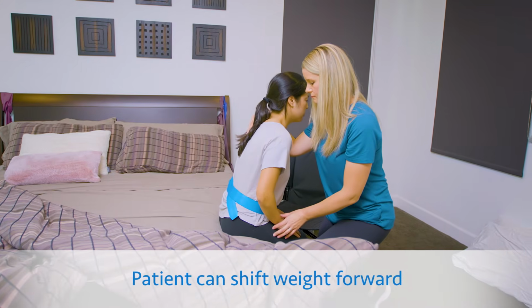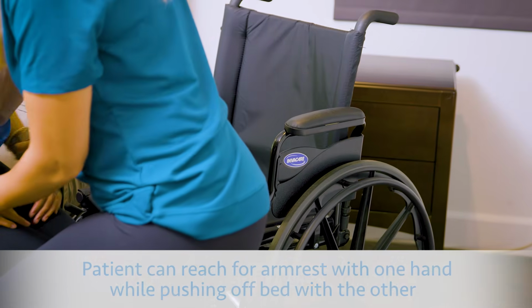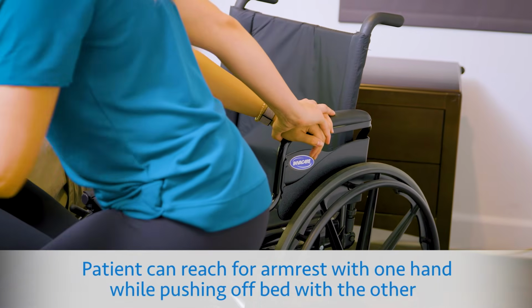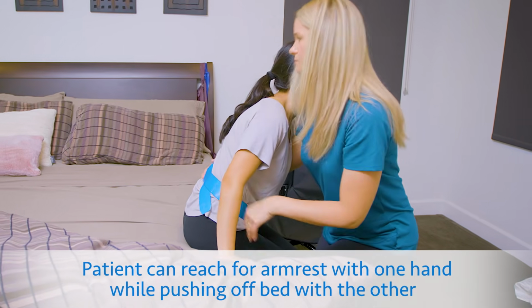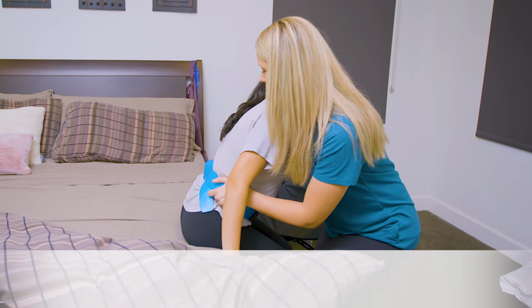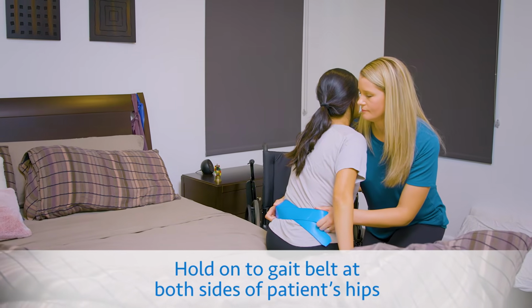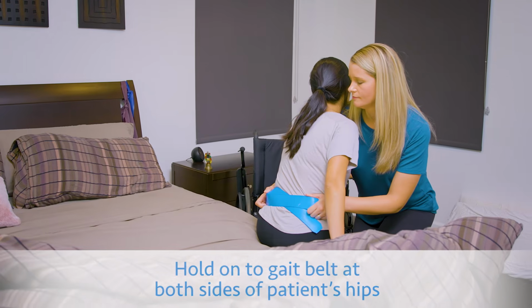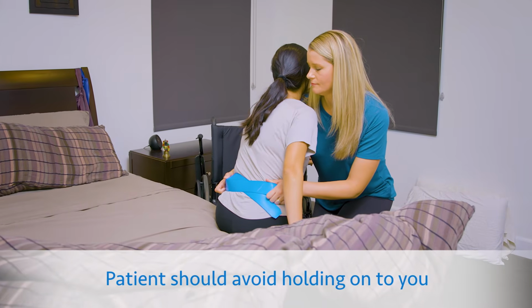At this point, the patient can lean forward to shift their weight forward. If the patient is able, they can reach for the nearest armrest on the wheelchair with one hand, while pushing off the bed with the other to assist you with the transfer. Hold on to the gait belt at both sides of the patient's hips to serve as a point of control for leverage during the transfer. The patient should avoid holding on to you, as this may cause injury.